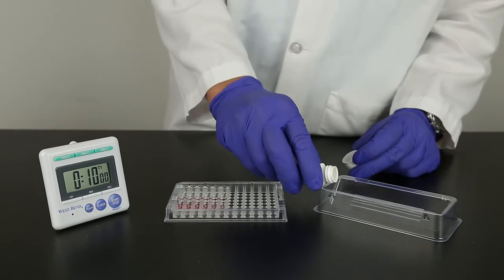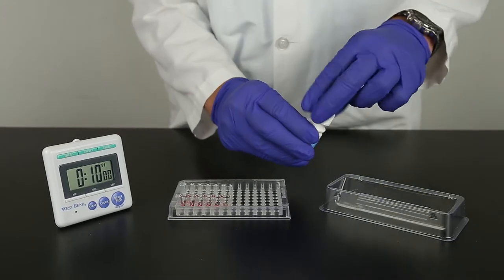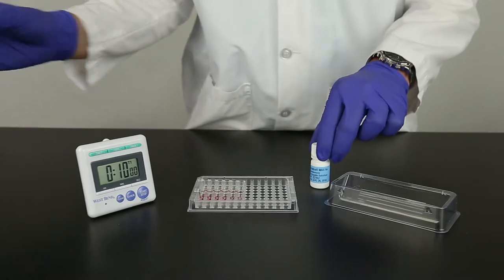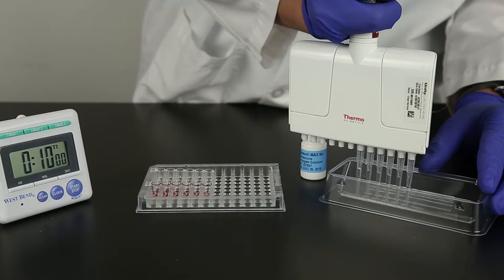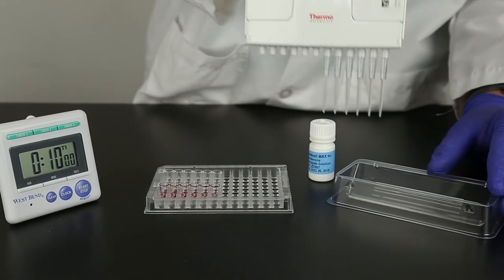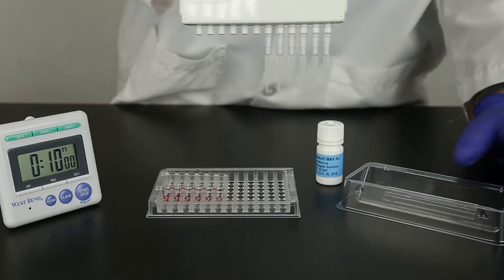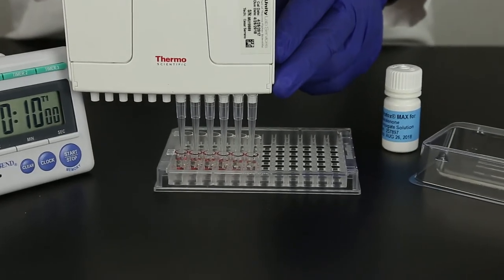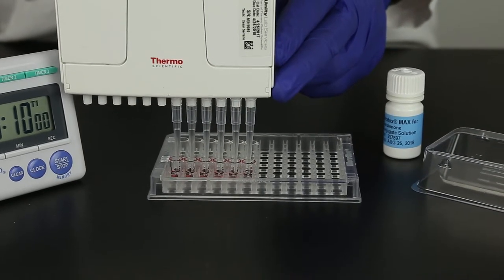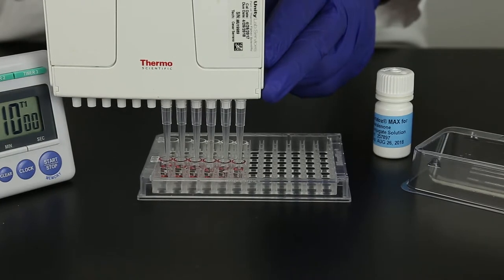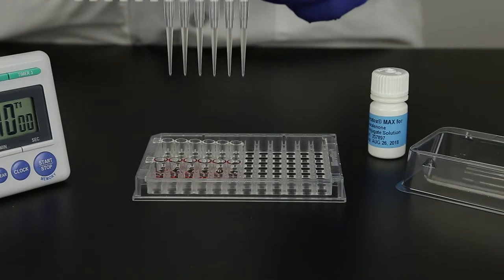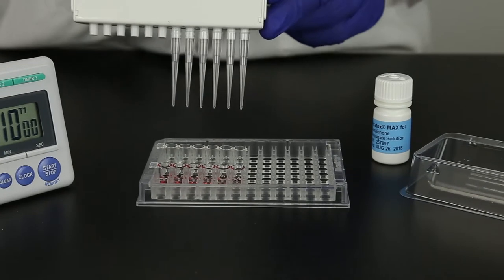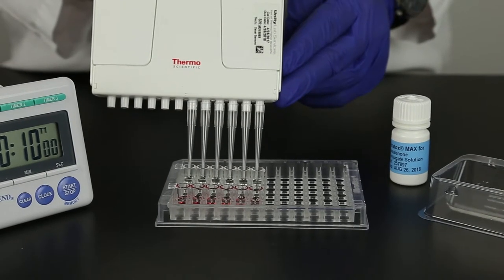Pour the needed amount of conjugate into a clean reagent boat. Using the 12 channel pipetter, prime and pipette 100 microliters of conjugate into each red marked well. Check to be sure there are no air bubbles and the tip is fully loaded. Mix the conjugate and samples in the red marked wells by carefully pipetting up and down five times. Draw up 100 microliters making sure no bubbles are present in any of the tips. Transfer 100 microliters of sample into the clear antibody wells.